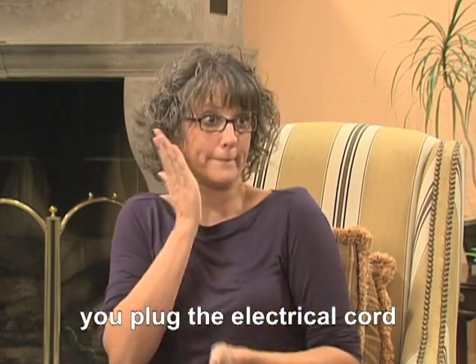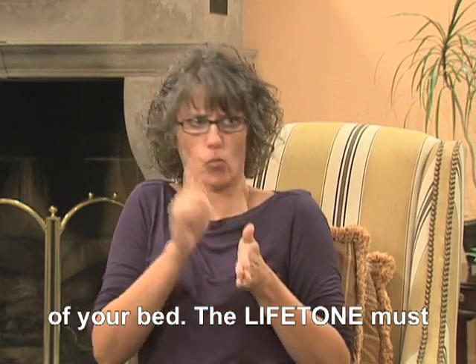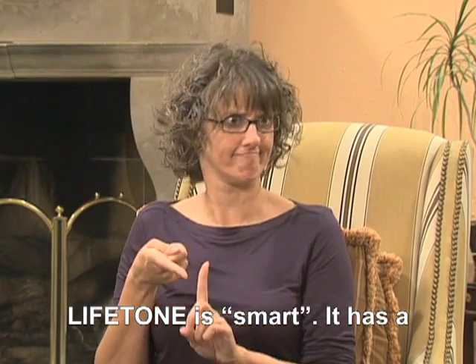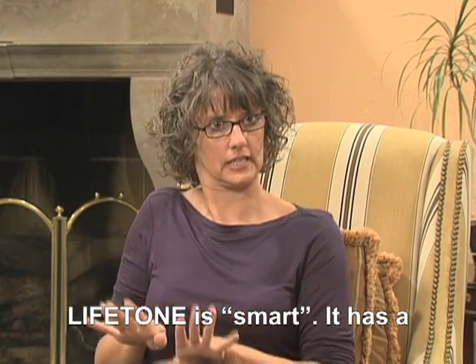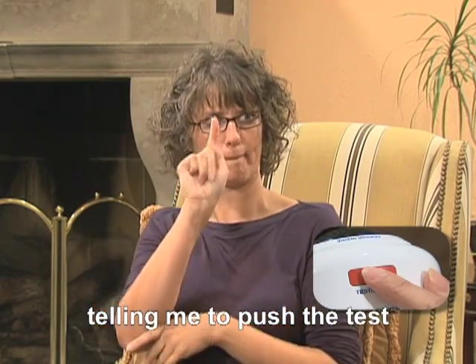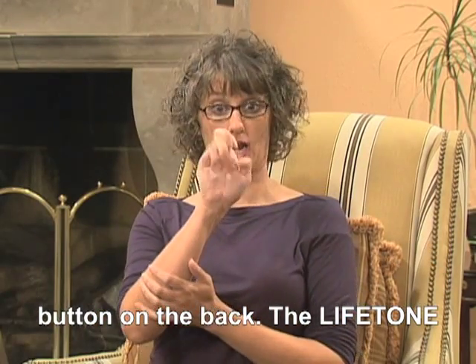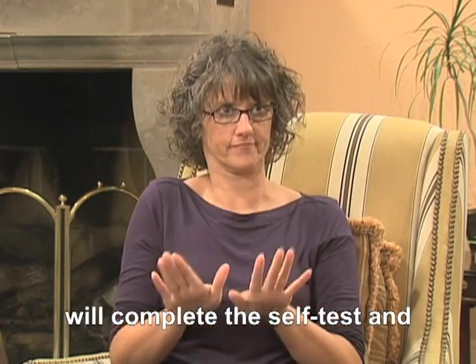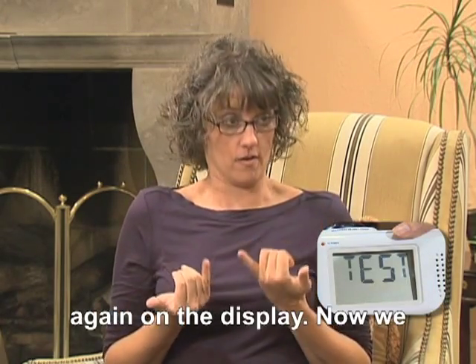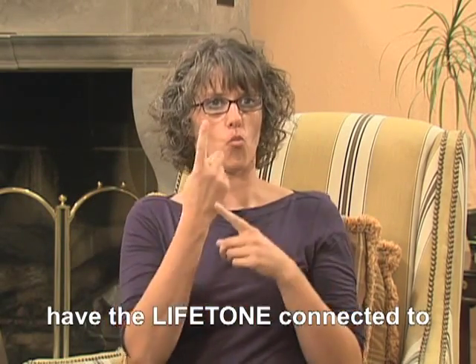Next, you plug the electrical cord into a wall outlet by the head of your bed. The Lifetone must be located where you sleep. The Lifetone is smart. It has a self-test. The display is telling me to push the test button on the back. The Lifetone will complete the self-test and then we will see the word test again on the display. Now we have the Lifetone connected to the electrical power.